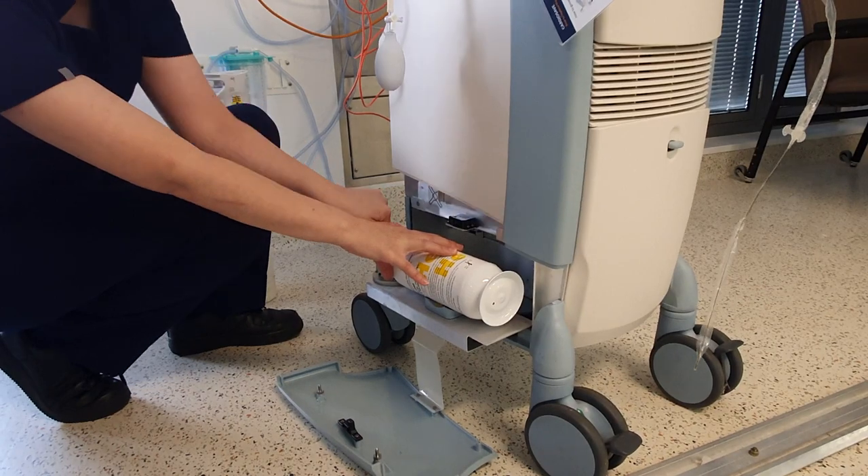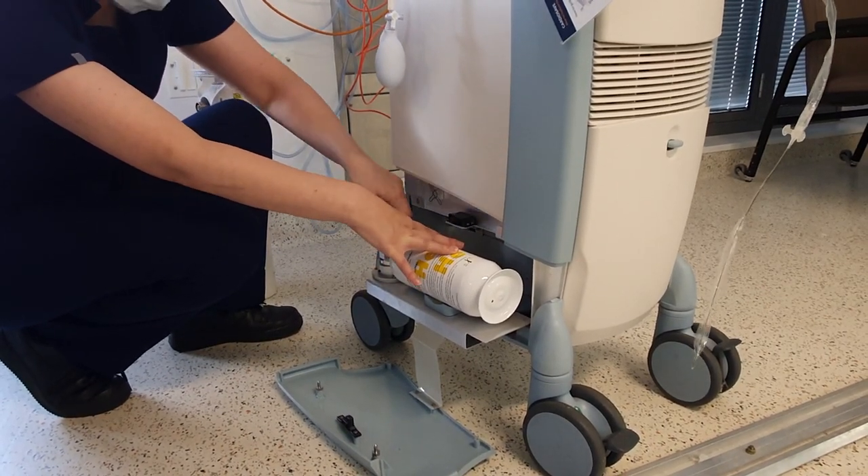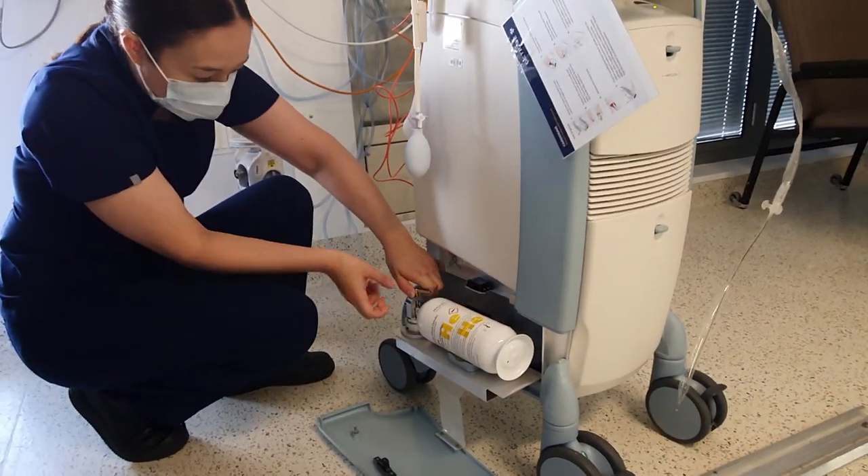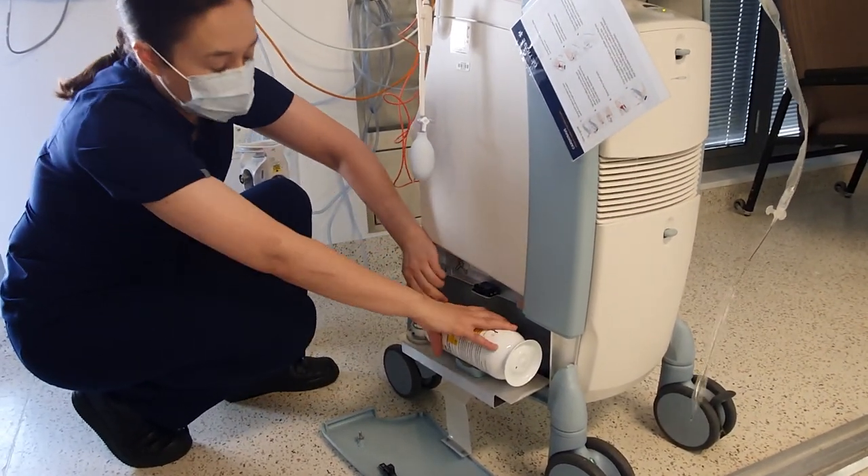If you haven't tightened it properly, you'll hear a loud hiss. Don't worry — just work your way backwards, close this part, and fix the tank up.